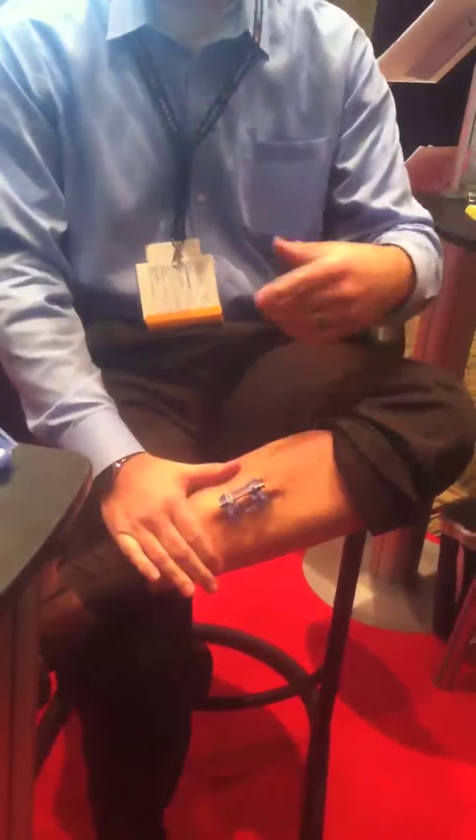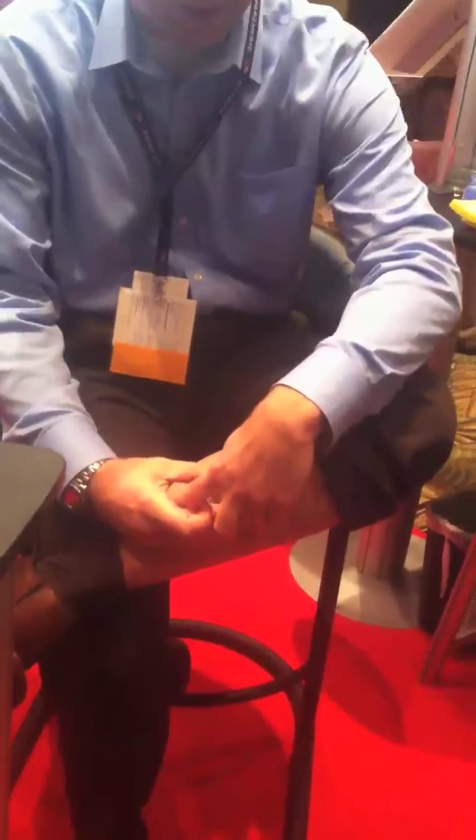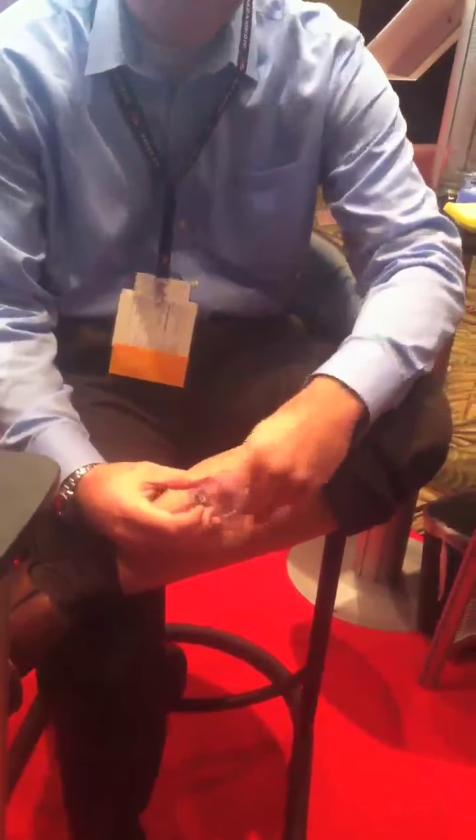So you're going to bleed when you take it off? I will — I'll have some capillary oozing. When I did it the first time, I just put a paper towel or four-by-fours over it and wrapped it up. An hour or two later I took it off and just had some spots of blood — not a blech or anything like that. To remove it, just like we showed, you have to squeeze it down, press the pins in, and rotate it out. The needles are about 3-0, so 20 gauge give or take. Every now and then you get one little spot that's going to be a bleeder, and that's the extent of the hemorrhage from the needle hooks.